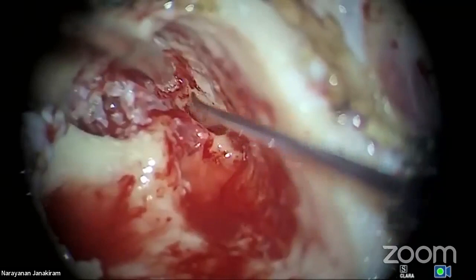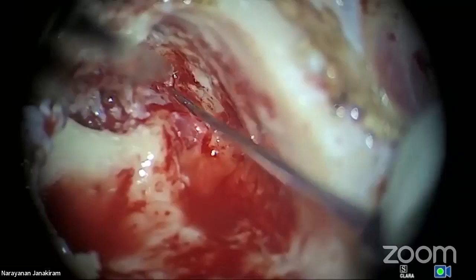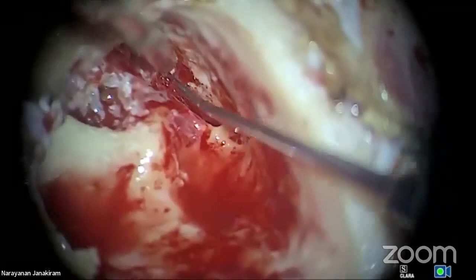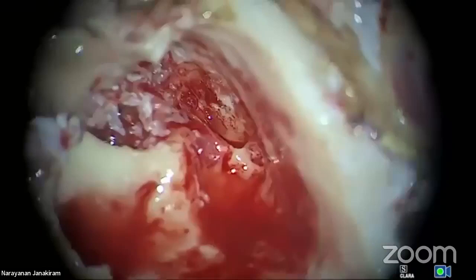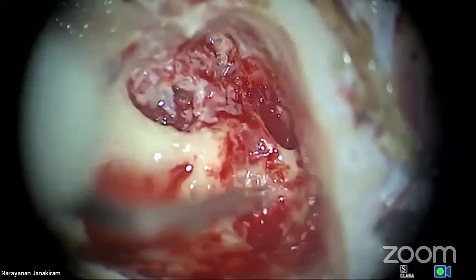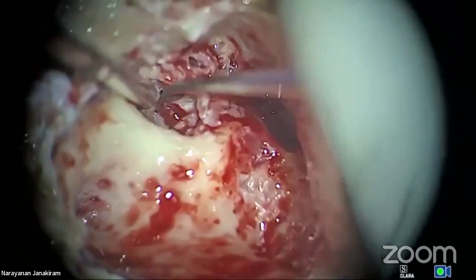Now that will be very close to the facial nerve. Be very careful. See, whenever I go near the facial nerve, my hockey is directed upwards. See, that's the facial nerve going there. Don't worry about that. Okay. Right. Now, having done that, now I'm going towards the, so lateral canal I've left behind a little, okay? Now I'm going towards the middle ear. Can you see, my dear friends?